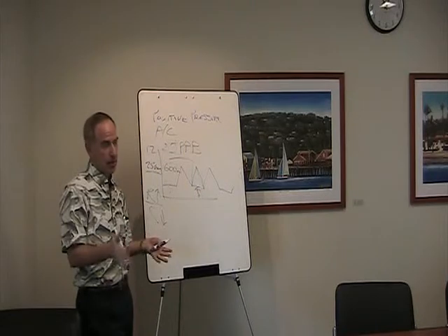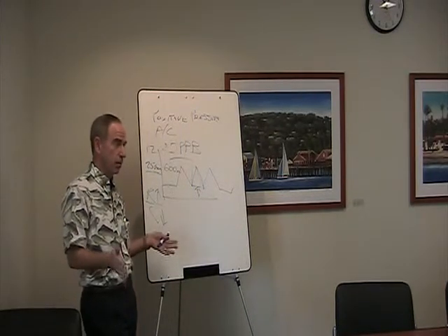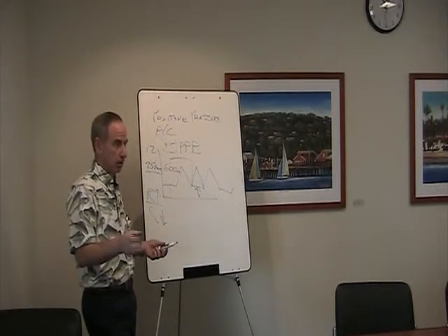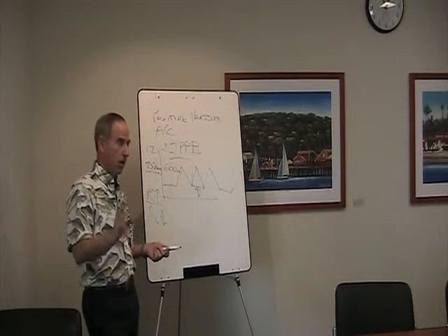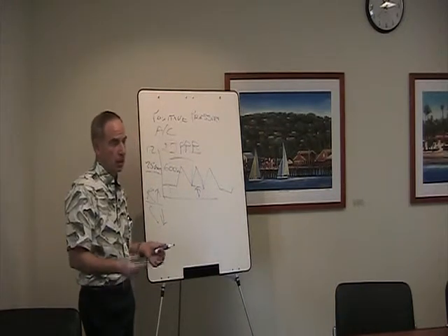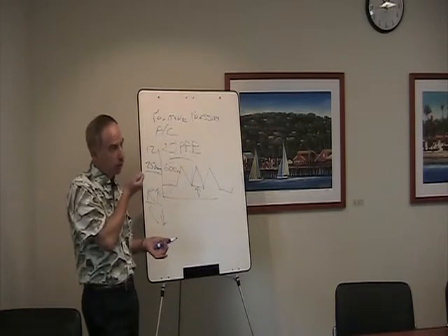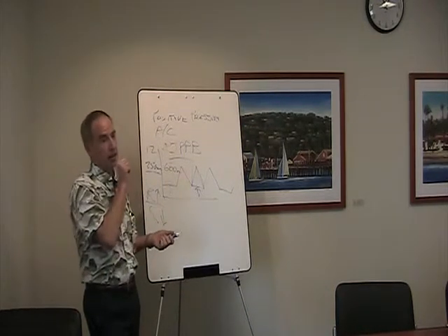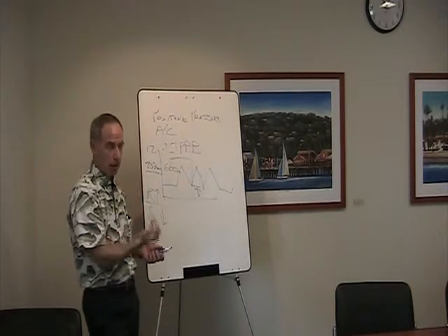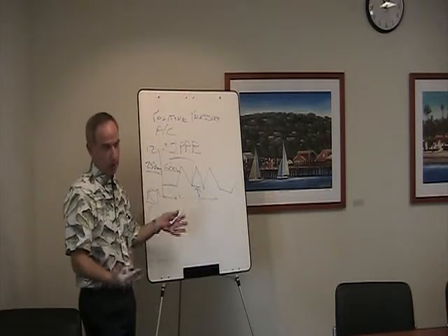So this device was actually designed mainly to give aerosol medications, but it could be used as a positive pressure ventilator. You could actually set a rate, but it was pressure cycled. So you set a pressure and a rate, and you could set the FiO2, or you could entrain oxygen through it. Normally, if you weren't ventilating them, there was just a mouthpiece, and the patient would suck in and the aerosol would entrain through it. When the patient took a breath, it would trigger a positive pressure and inflate the lungs, or at least that was the thought.